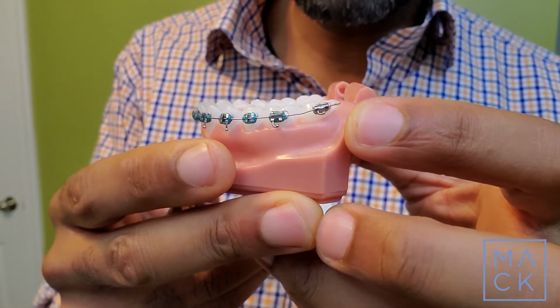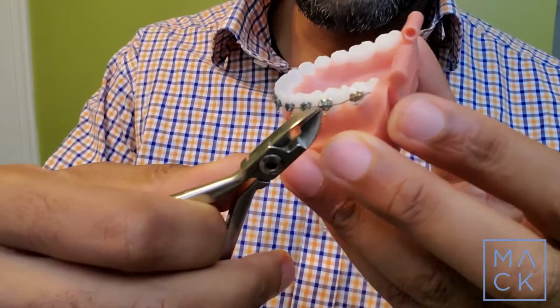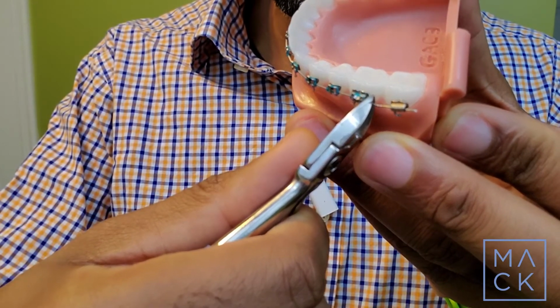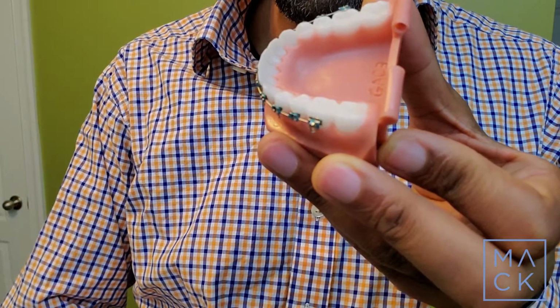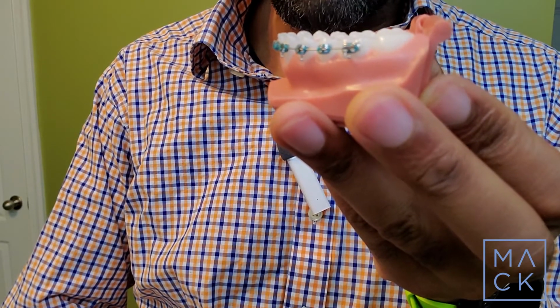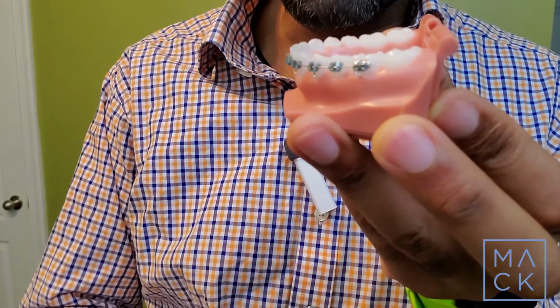Again, you can use a nail cutter or a cuticle cutter or even a trusty handy dandy wire cutter. What you want to do is cut the wire as close as you can at the bracket in front of where the bracket is loose. Then that whole section of wire will come out and be much more comfortable for you. If you have a little sharp end there, you can still cover that with a little bit of wax.